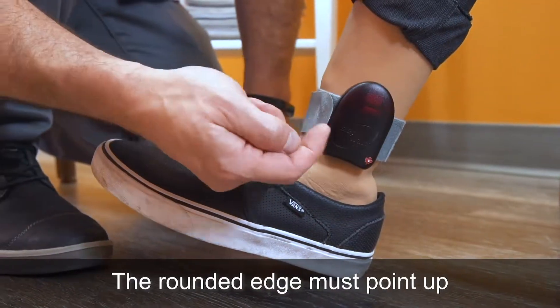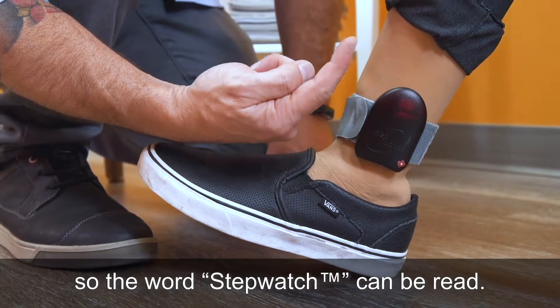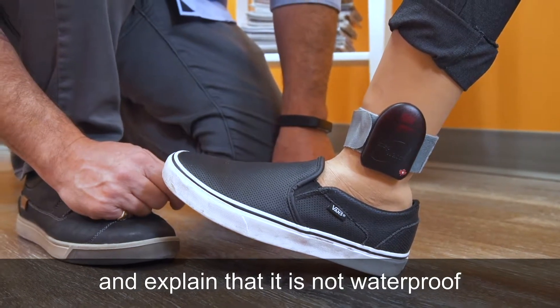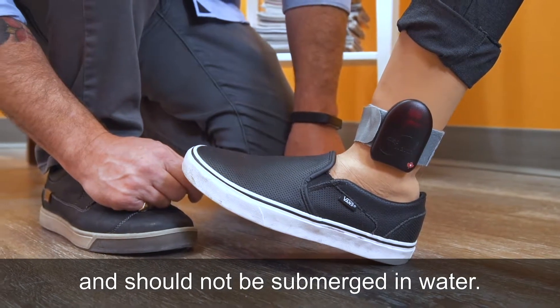Place the StepWatch around the patient's ankle or prosthesis on the affected side. The rounded edge must point up so the word StepWatch can be read. Instruct the patient to wear it every day and explain that it is not waterproof and should not be submerged in water.